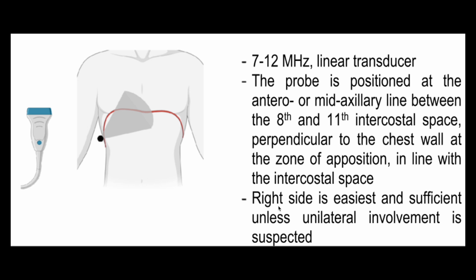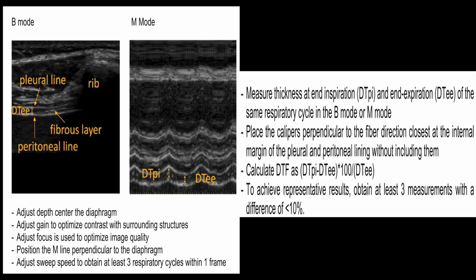The right side is again sufficient; left-sided isolated weakness is rare. The measurement here is slightly more involved. First, adjust depth to center the diaphragm in the image.